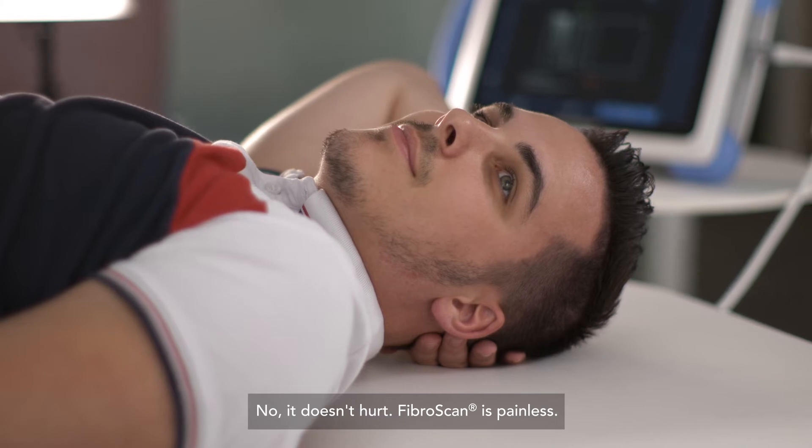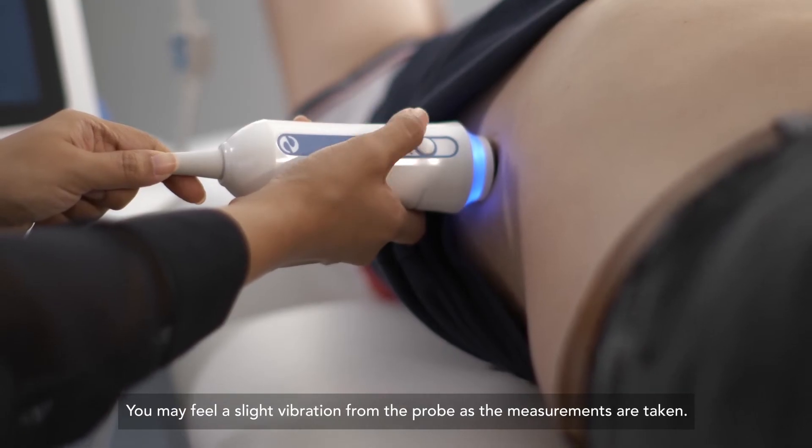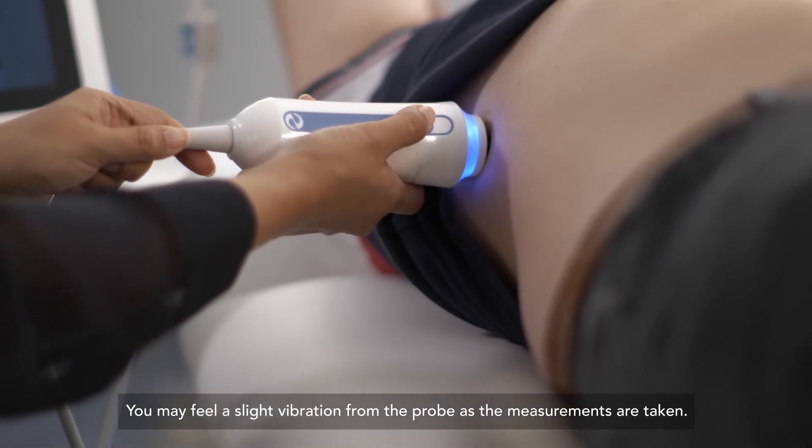No, it doesn't hurt. FibroScan is painless. You may feel a slight vibration from the probe as the measurements are taken.